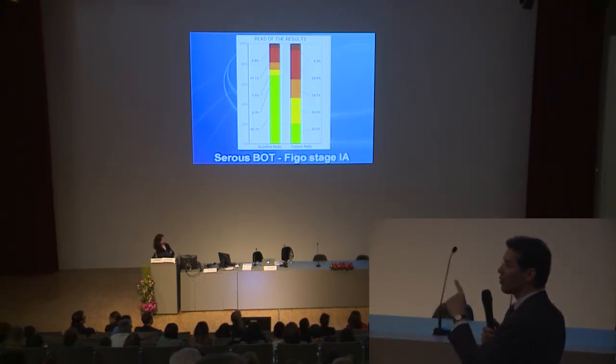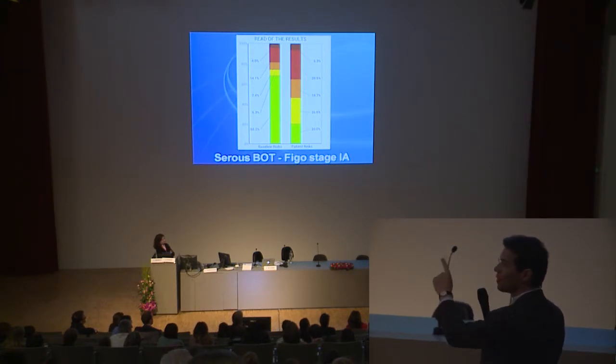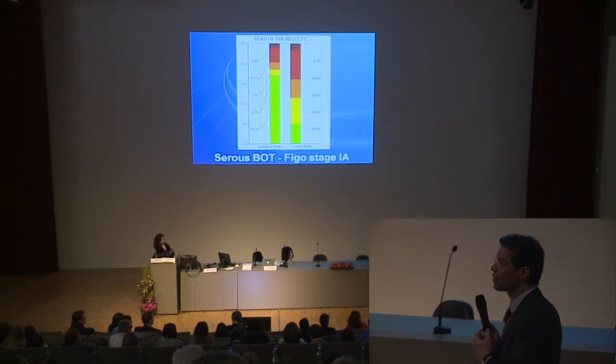So if you're working in a regional hospital, your left column will be much more green than if you're working in the center with Daniela in Prague. Then in your left column, there will be little green. You see, so the prior risk of the patient entering your unit is different. This is the average for all IOTA patients. So we might need to adjust this to the type of center you're working in.